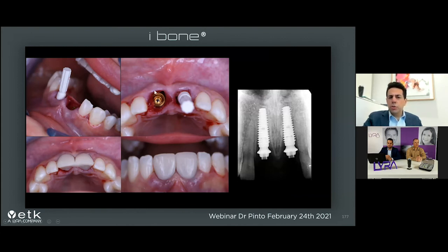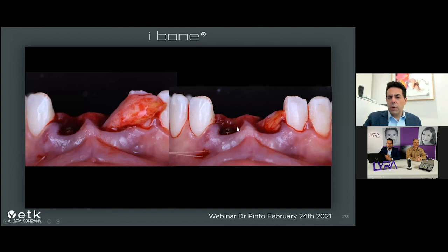So we choose, like I told you before, the pilier tetra abutment. It means that we put it immediately during the surgery and we will not remove it after. We fix it immediately, and the only thing is that we put a temporary abutment directly on the tetra abutment. We try the temporary crown, but we see that the gum is very thin. So we decide to add a gum graft to augment the poor situation of the patient and to provide us some security for the future.